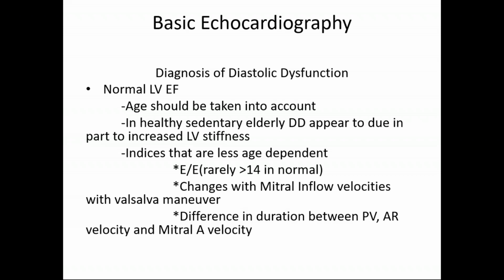Okay, but when you look at your EE prime ratio, it's not going to be elevated. And when you look at other parameters for diastolic dysfunction, they're going to be normal. So they may have a small e and a big A, but when you do your other evaluation for diastolic dysfunction, it's not there.